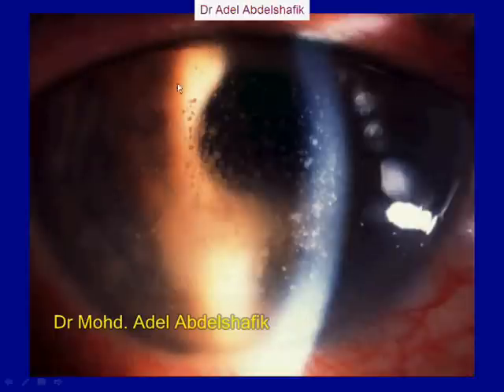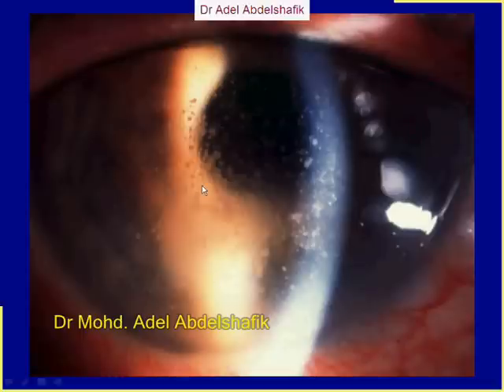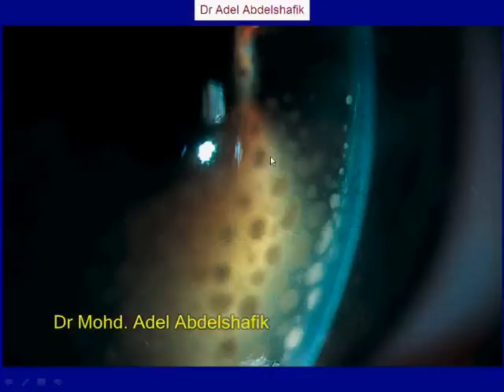the iris surface? Is it the same here, this area, compared to that, the light you are seeing? Is it the same? So this will give me the impression that this part of the cornea is not as clear as this part. This is one of the ways to diagnose some edema or haziness, at least, whatever the cause of this haziness. So not all the time you have to concentrate on the section, but see around the section you are examining. What do you see here?